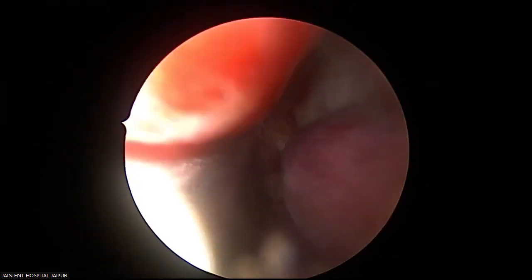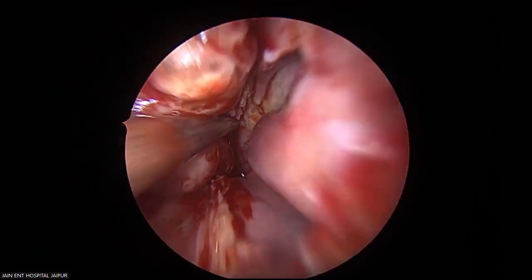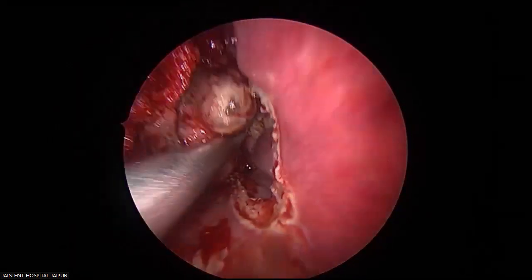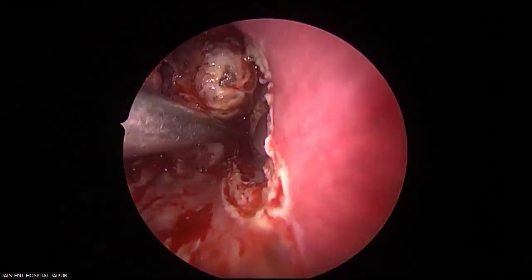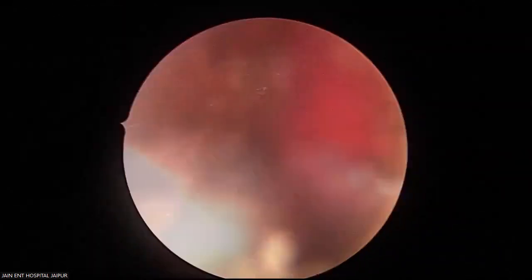See the exposure from the medial side and behind? I hope you are oriented. Yes, yes. Tumor has been lifted.